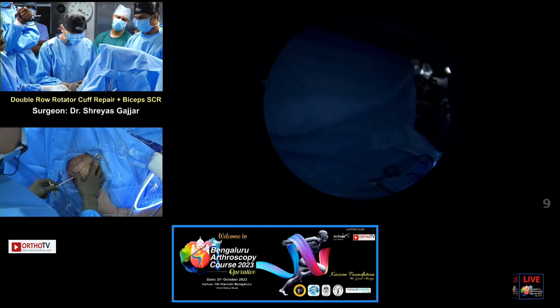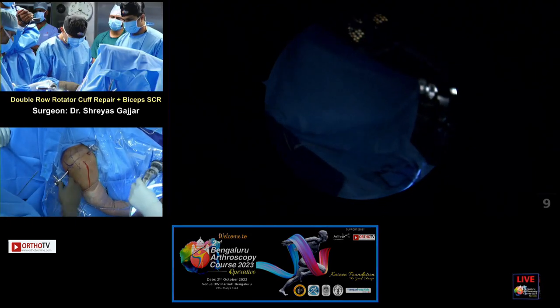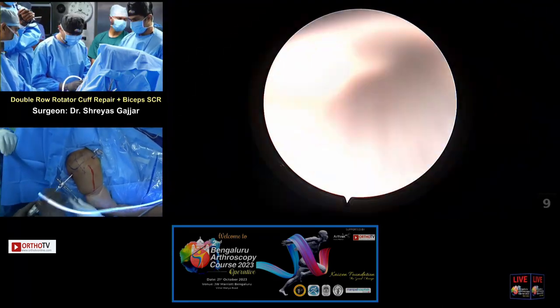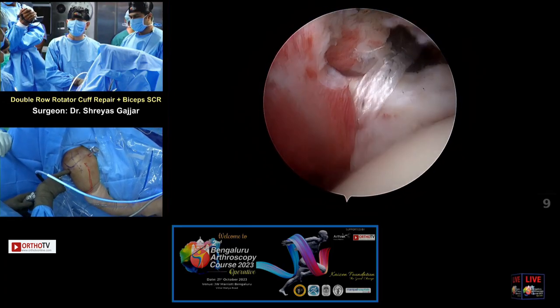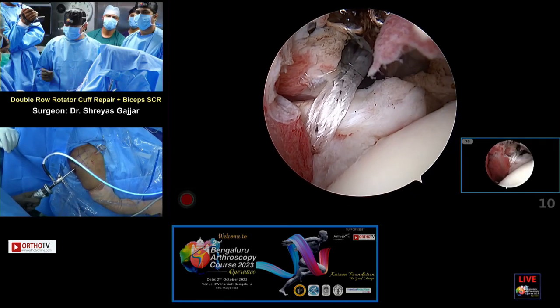So I'll go back to the glenohumeral joint. I use a traction device, in this case the Trimano. I think it's important to have a traction device whether you do beach chair or lateral position. It makes the job easy, otherwise the assistant has to hold the arm. So have you got the glenohumeral image? Yeah. Okay.